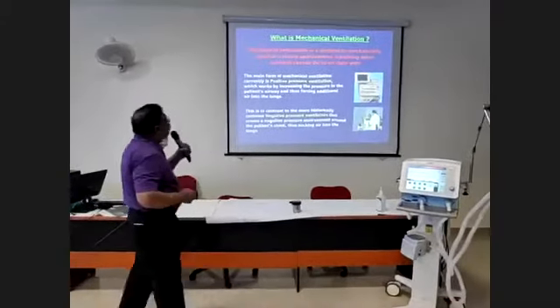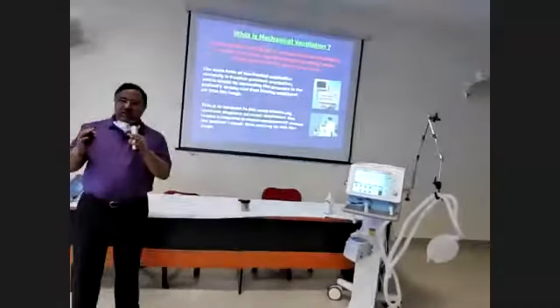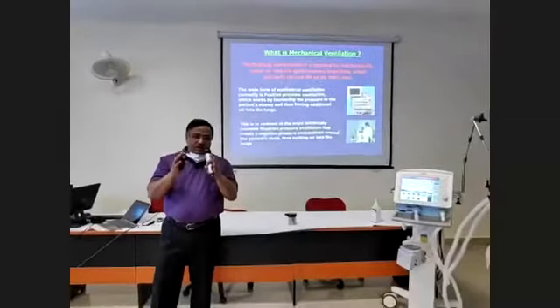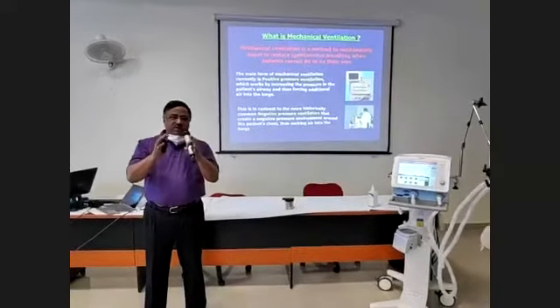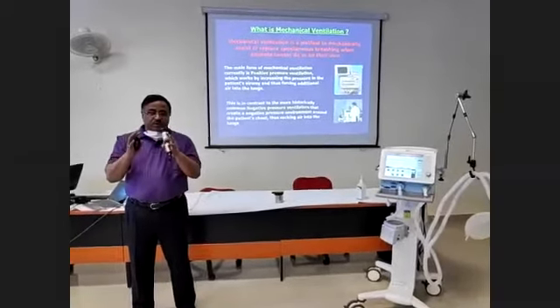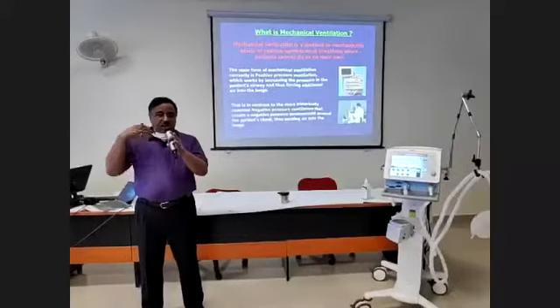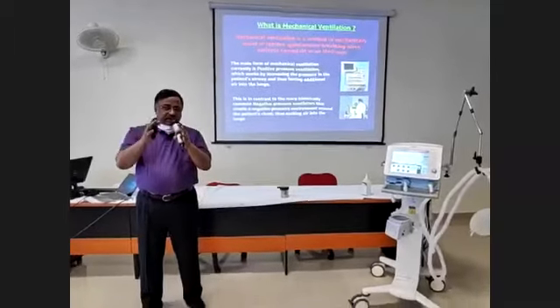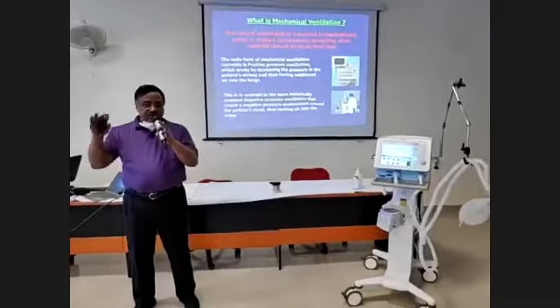Okay, so what is mechanical ventilation? When you are talking about mechanical ventilation, you are trying to connect a non-living object with a living object. And what you expect is that the non-living object will work as per the need of the living object. You have to understand this because it is very important. When you connect a non-living object to a living object, the demand of the living object has to be fulfilled by this non-living object. And the settings which you do on this non-living object will actually take care of that living object.